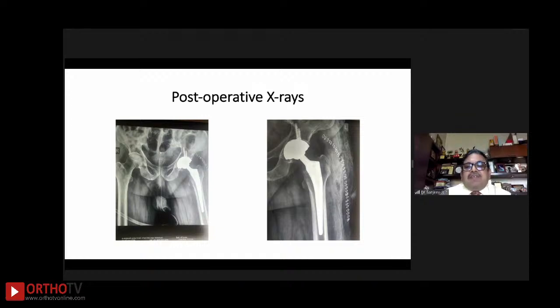As I correctly and very frankly said, we need some very well selected cases, like here, an 84 years old male with Parkinsonism, to also have first-hand experience with how the dual mobility works in our hands, in my hands possibly. That is one of the reasons I would like to do a dual mobility in a few selected cases.